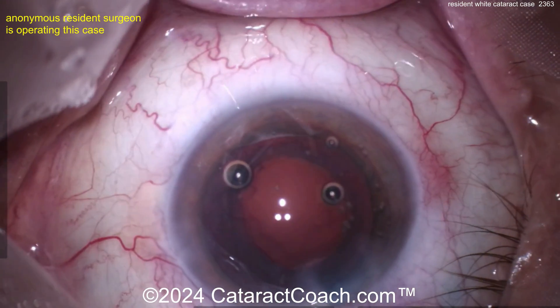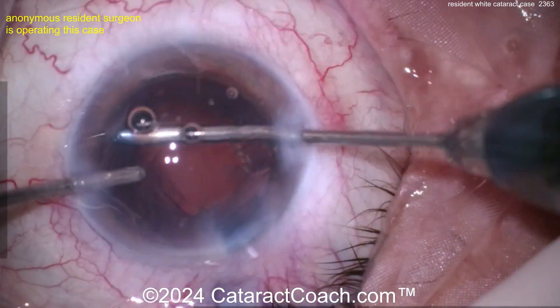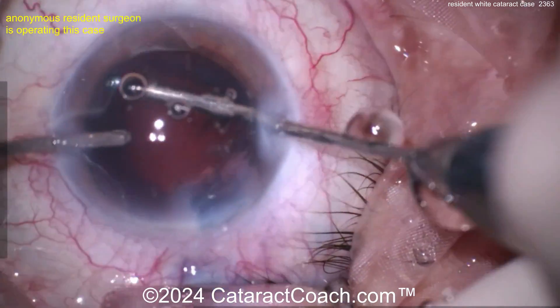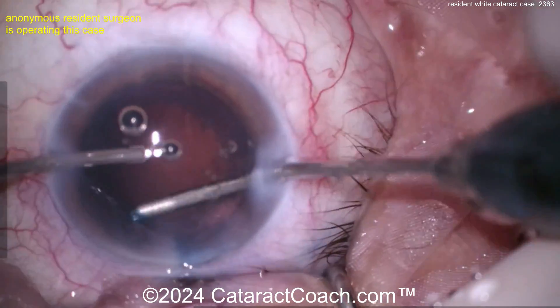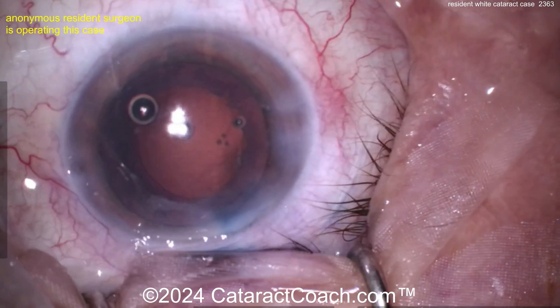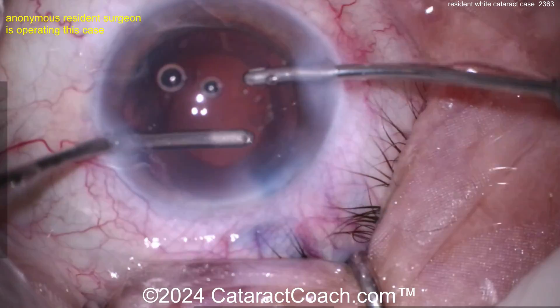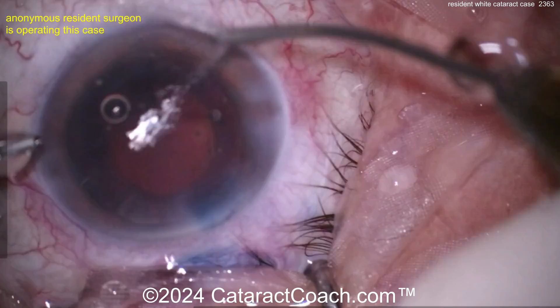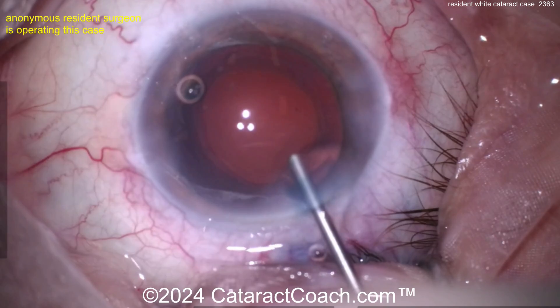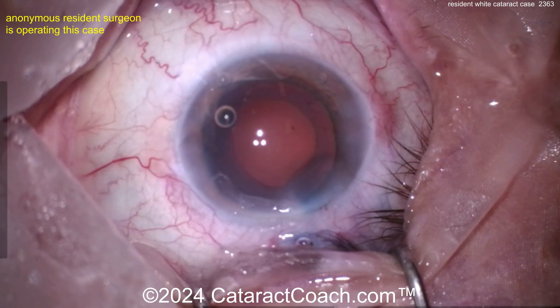Nucleus all cleaned up — now time for cortex removal to finish up the case. You should definitely learn how to do a white cataract in your residency training program. The bimanual approach for cortex removal is always good — gives you fine access. There is technically another incision but it's just a small paracentesis with no consequential effects. You can switch hands and clean up the other way. You see what I mean about the draping — you could put some plastic drape there and really get the lashes out of the way.